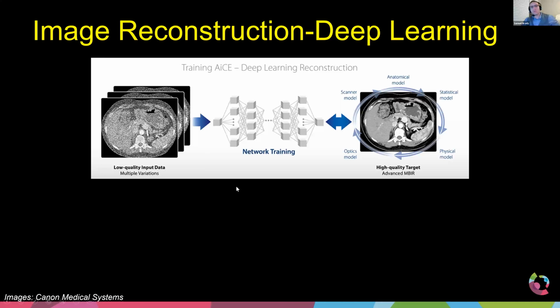And what we do is we need to train that network. We need to train it to find something specific. It's one thing to just take that image and break it down to its teeny little pixel values and then put it all back together. But if we do that, and as we're taking it apart layer by layer by layer, we're trying to teach it to find something, for example, noise, then the system becomes exceptionally good at figuring out what is noise and what is not.